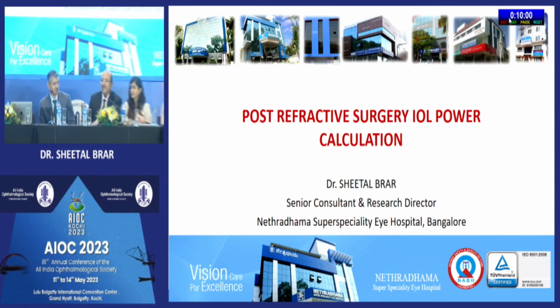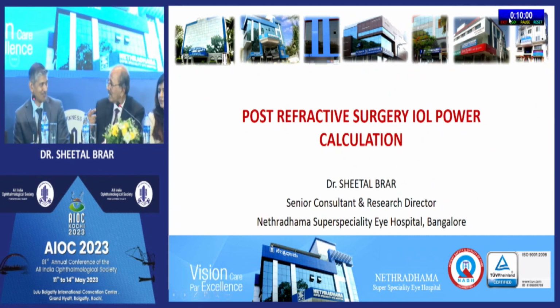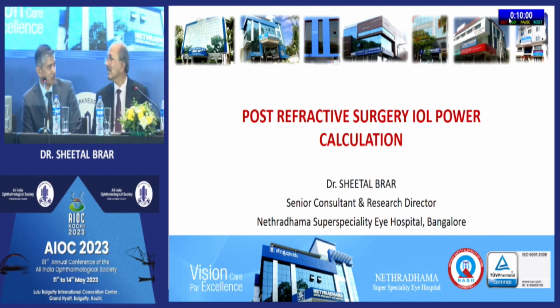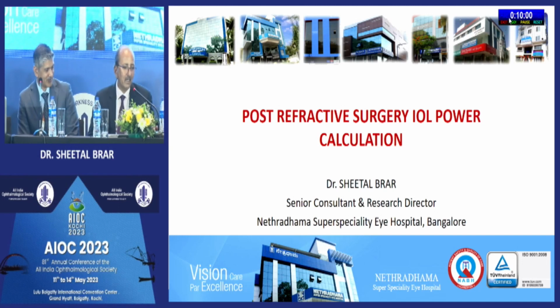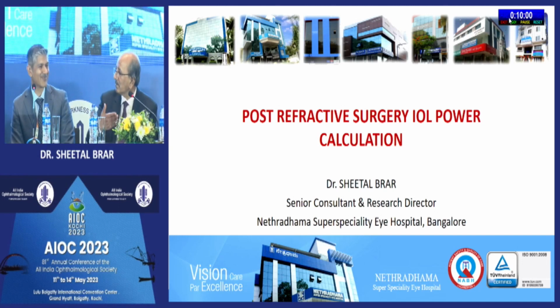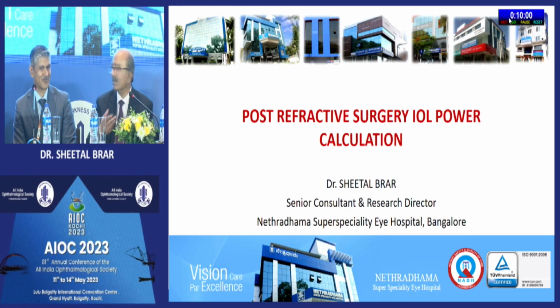Great. So there appears to be more rotation if there is a residual viscoelastic. Yes. I think your study also showed that, no? Yes. That's why I like to inject under BSS. I don't like to use viscoelastic. That is a nice study which shows that if there is a lot of viscoelastic, there may be more rotation, particularly higher rotation.